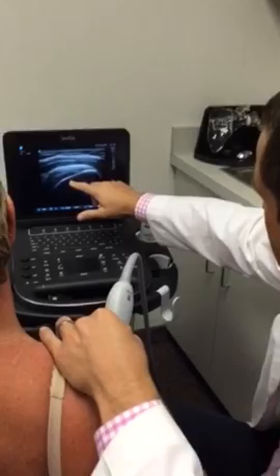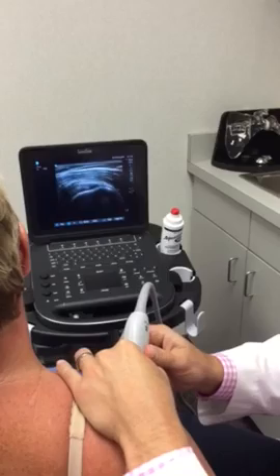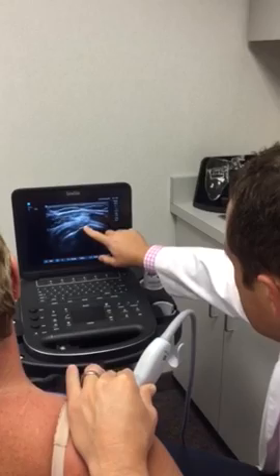This right here is the supraspinatus tendon. Make sure you probe anterior all the way until you get to the biceps tendon coming across the humeral head — that way you know you've got the entire supraspinatus. This is the subacromial bursa, this is deltoid, and as we probe back, we're getting into the infraspinatus.